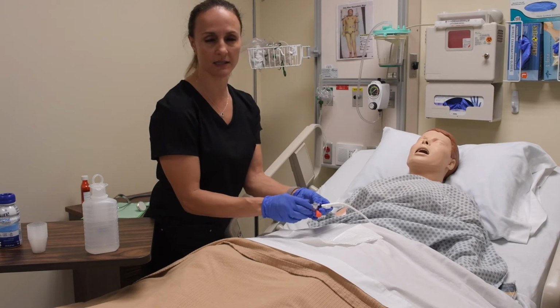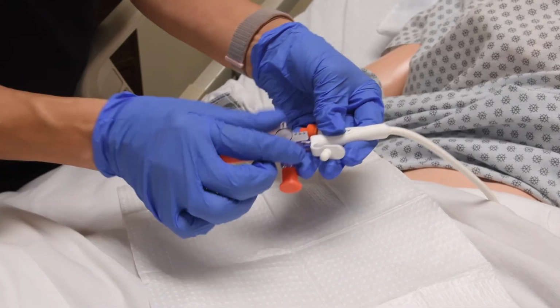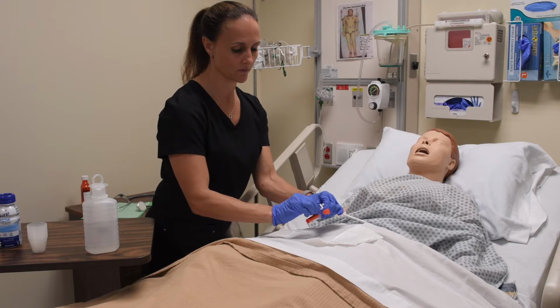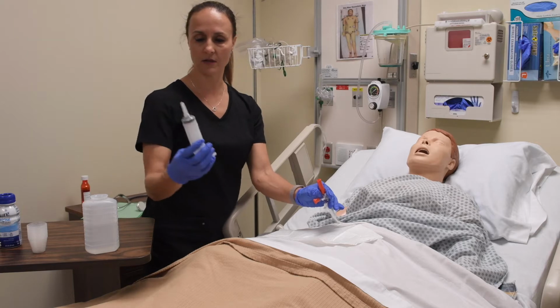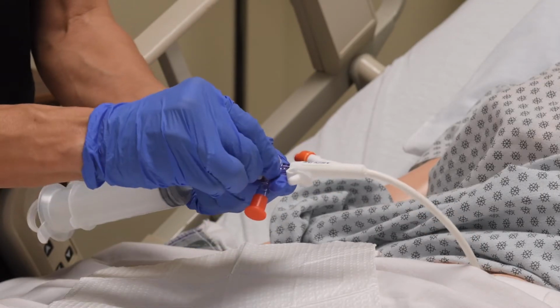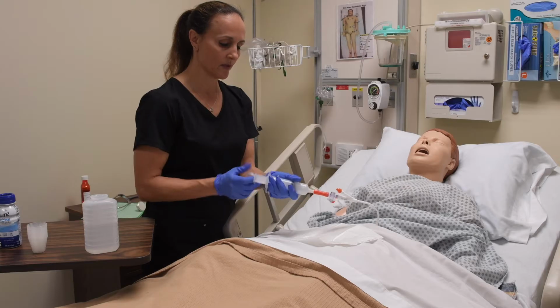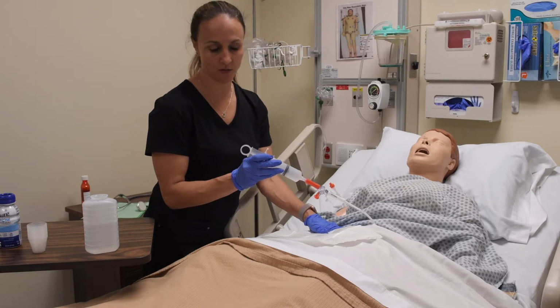Because my patient is not connected to continuous feedings, the valve is turned to the off position. First thing that I need to do is make sure that I check residual. I'm going to get my 60 ml syringe. I'm not going to have anything in it. I'm going to attach it to the patient, and I'm going to pull back. For the purpose of this demonstration, the patient doesn't have any residual.